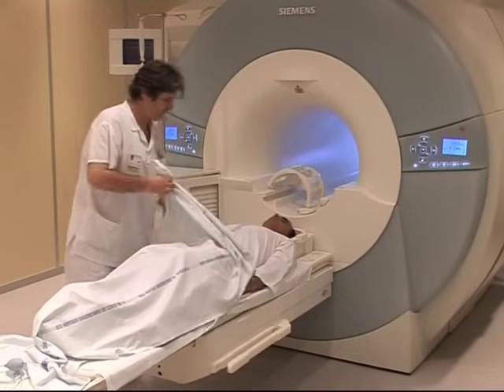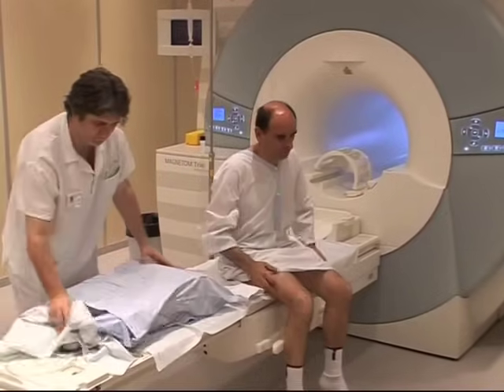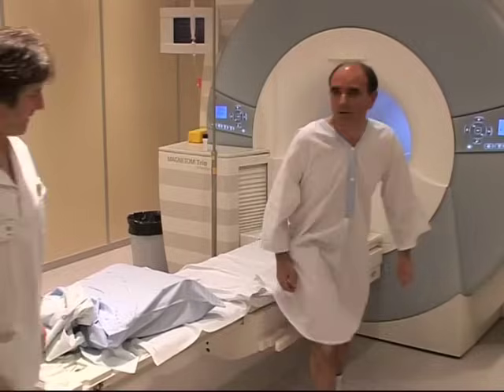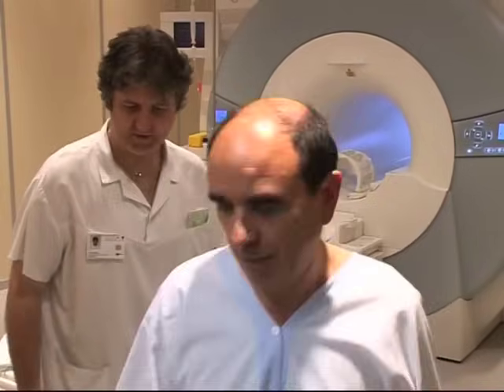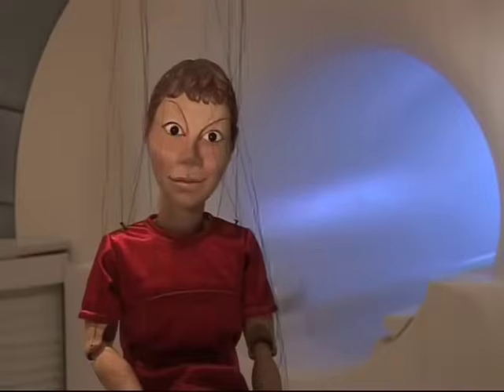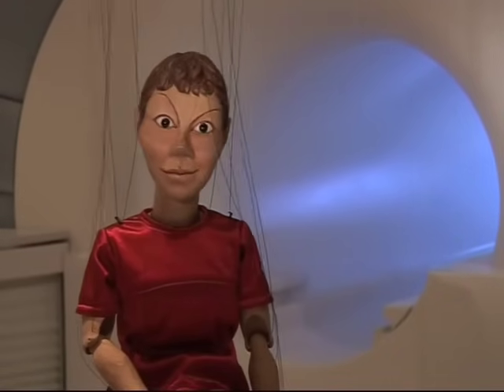You can sit up now. Careful, you might feel a little dizzy. The catheter will be removed and you can leave when the exam is over. I hope that I've been clear enough. But if you have any questions at all, please don't hesitate to ask us. And in any case, it will all be re-explained.